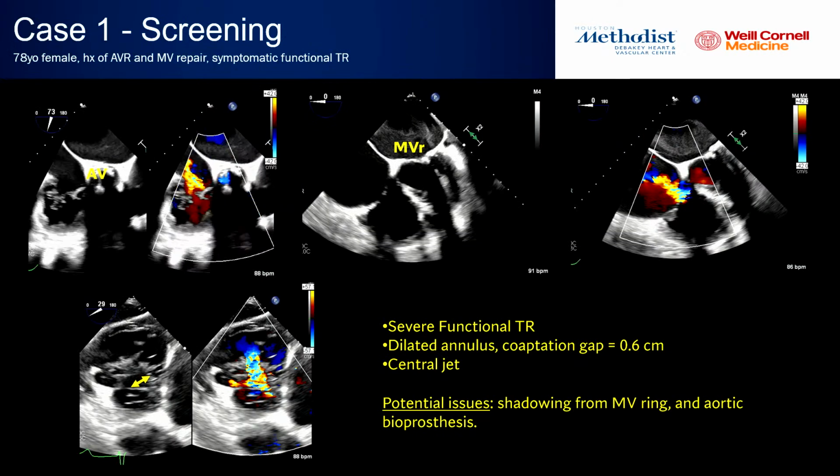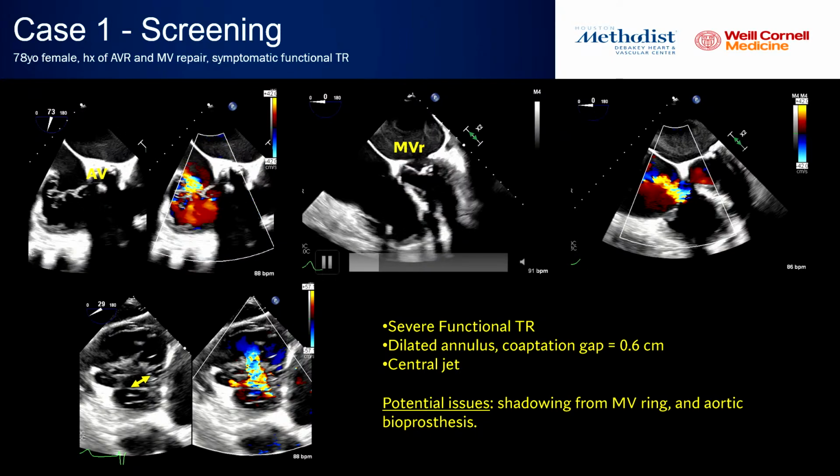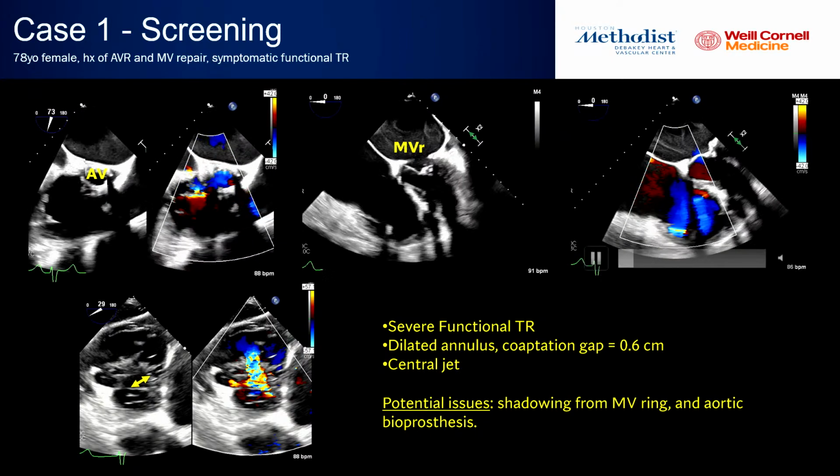And now we're going to go over the cases. I'm happy to take questions at the end. I believe we're going to be a little ahead of time.